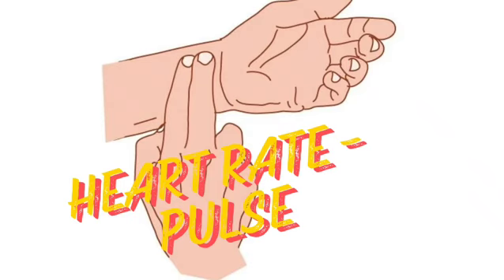The axillary is the most commonly used, but it is less accurate. If you are using the tympanic one, then we should check for any redness, any discharge, any swelling. If it is there, we should not use the tympanic one. After temperature, I will discuss the heart rate, that is the pulse.